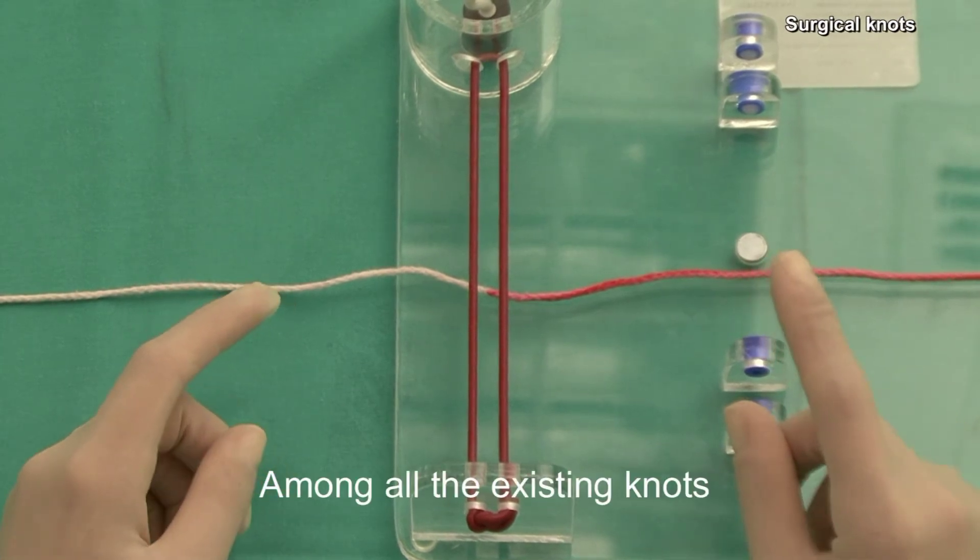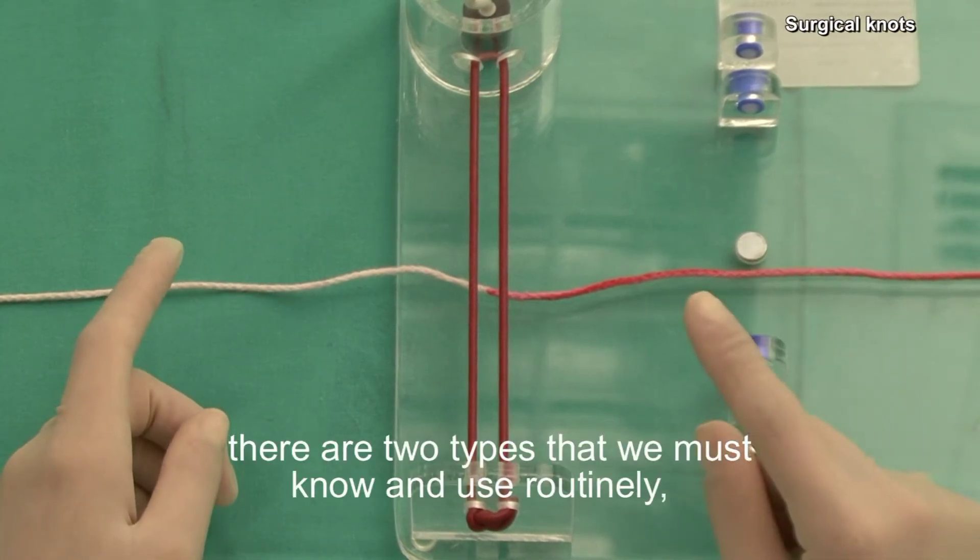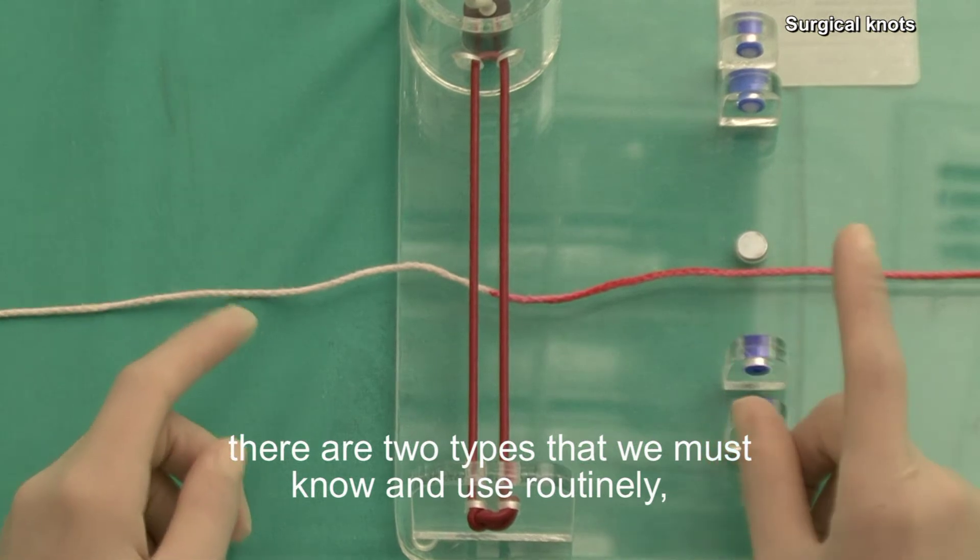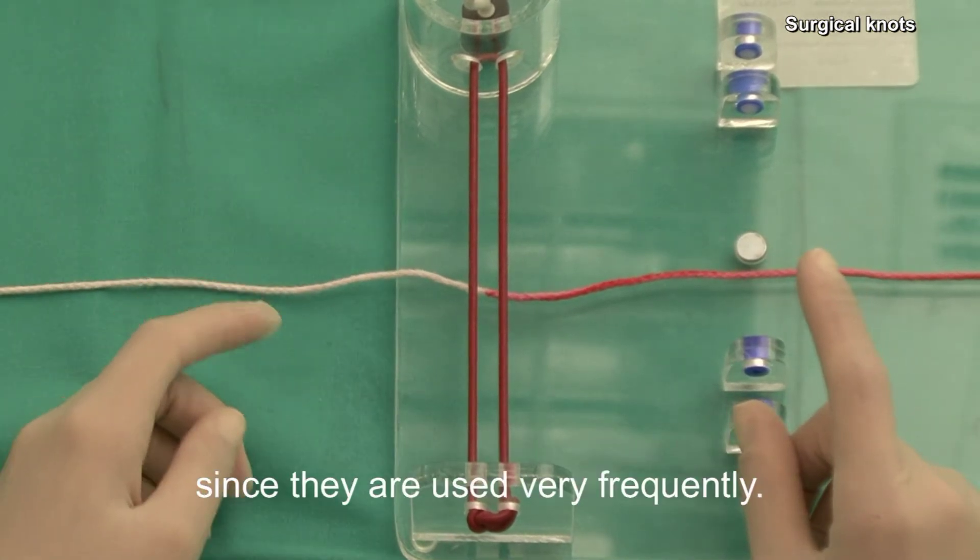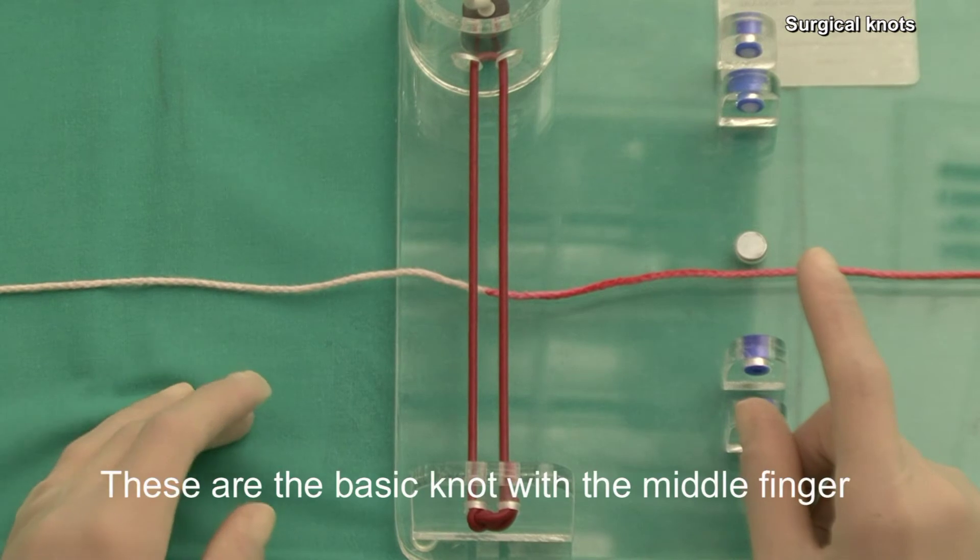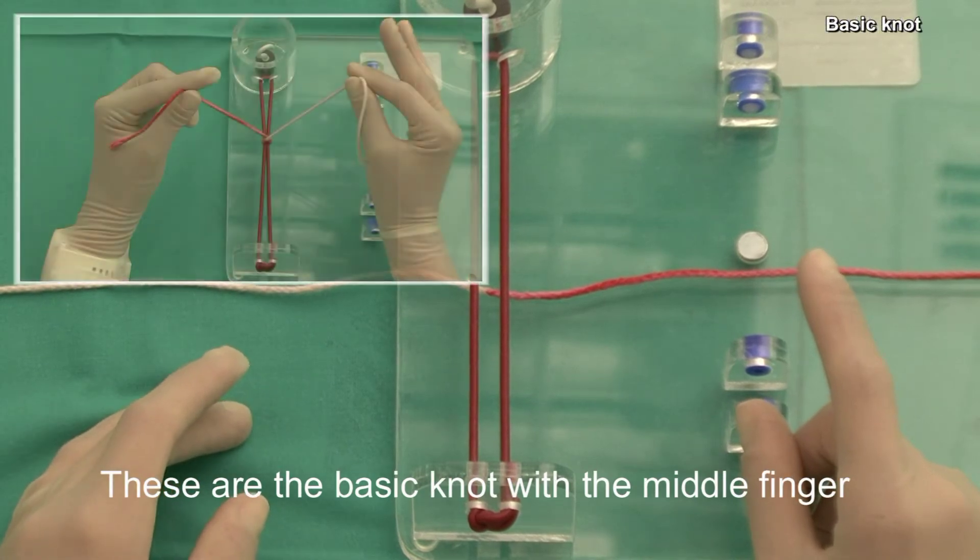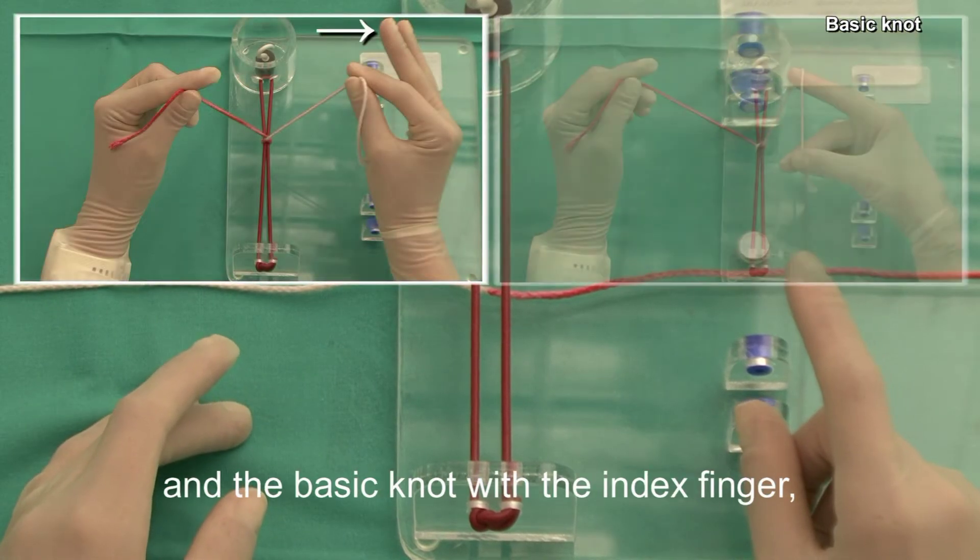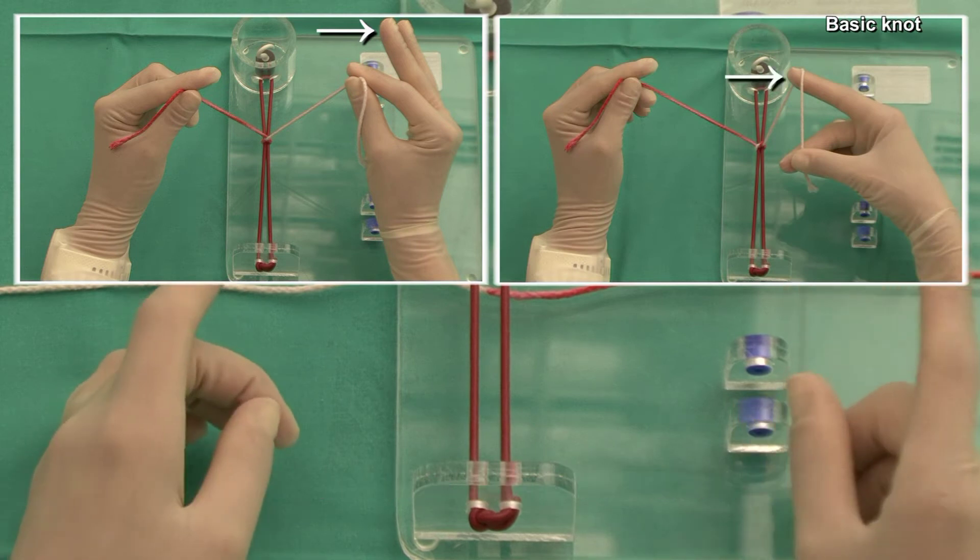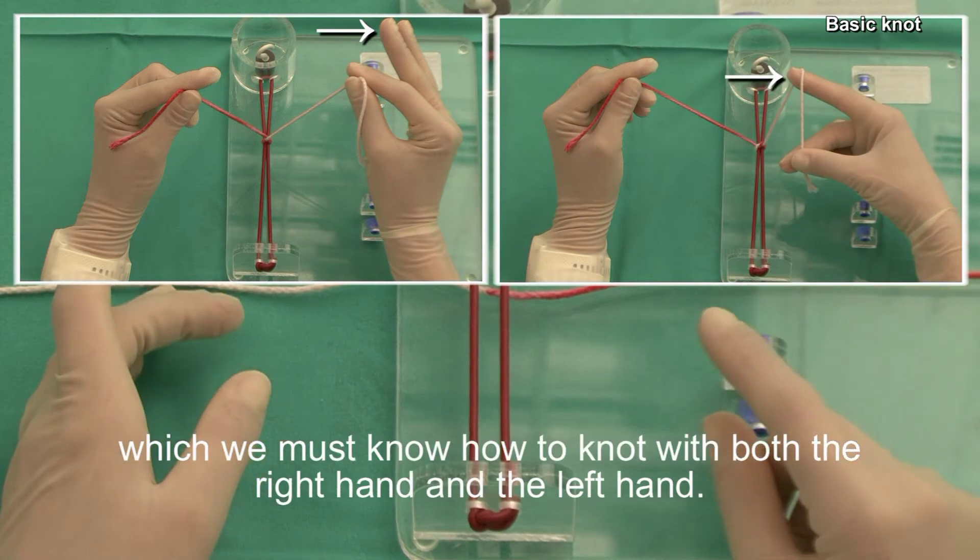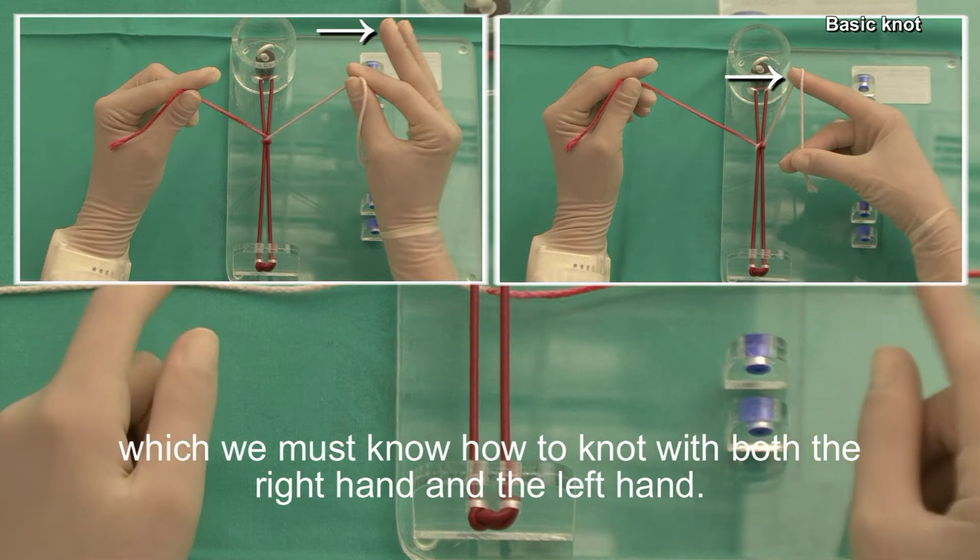Among all the existing knots, there are two types that we must know and use routinely, since they are used very frequently. These are the basic knot with the middle finger and the basic knot with the index finger, which we must know how to knot with both the right hand and the left hand.